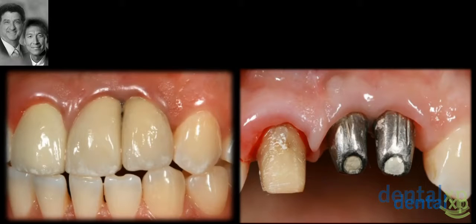the papilla is highly short. If you take a look at the right screen, you see the papilla is short compared to the natural papilla on the adjacent teeth. Now, why is that? What is it about the natural tooth that holds the papilla and that is not there between two implants? We're going to come back to that in our discussion, because we have to face that to see how we avoid this problem, and if it does happen, what do we have to do about it? Next, please.